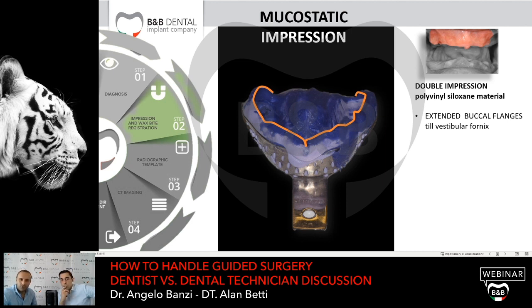As I told you before, the system requires a static mucosa. So the first thing to remember is that when I take the impression, because it is a double impression, I do not have to push too much over the soft tissues.